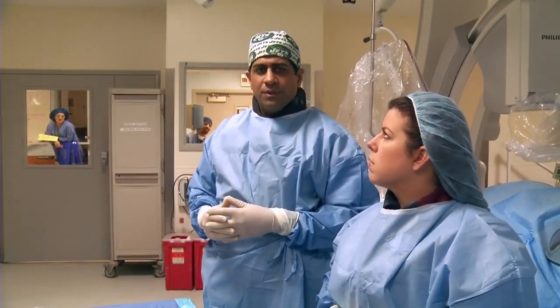Certain contraindications to going transradial include an abnormal Allen's test, or if patients have an AV fistula for dialysis. A relative contraindication is if they have a vasospastic disease, i.e. Raynaud's. They're probably not an ideal candidate for the radial artery approach. So as we can tell from those contraindications, a vast majority of patients are great candidates. So we're going to get started with the procedure.